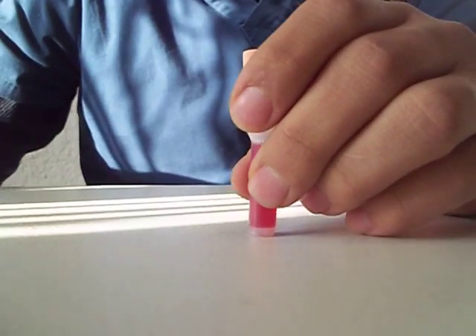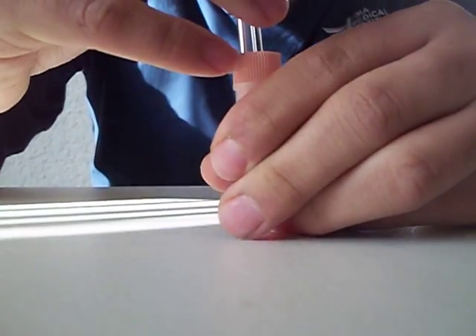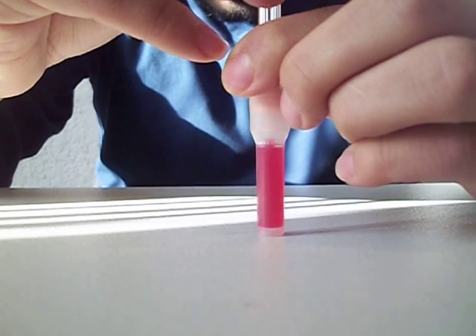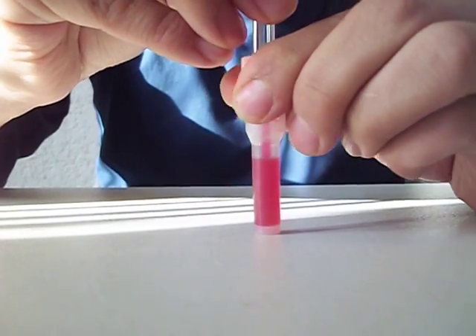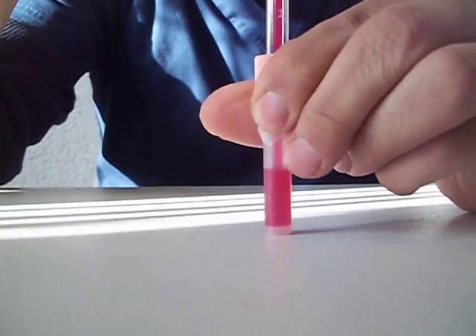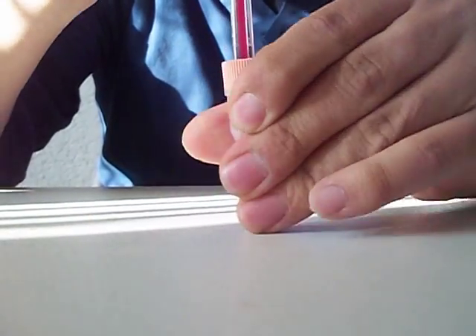Then after that I'm going to get the measuring device and I'm going to push kind of hard like that, pushing down and at the same time twisting it. There we see the blood is going to the measuring device, as you can see. I'm just going to kind of twist it.